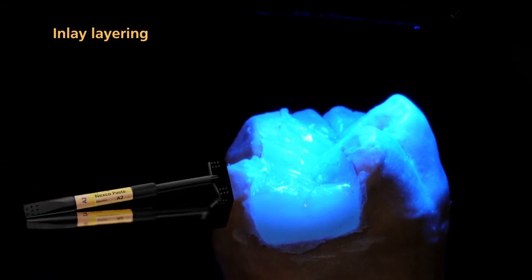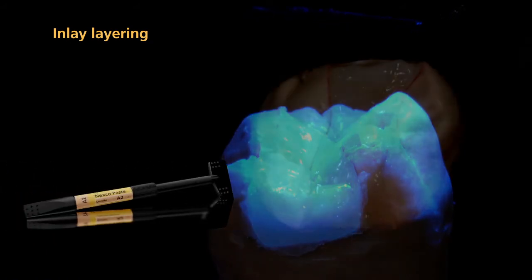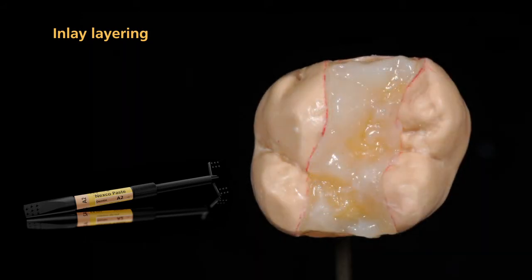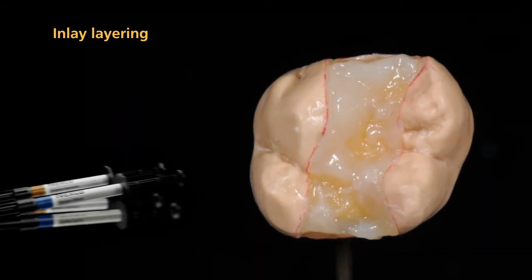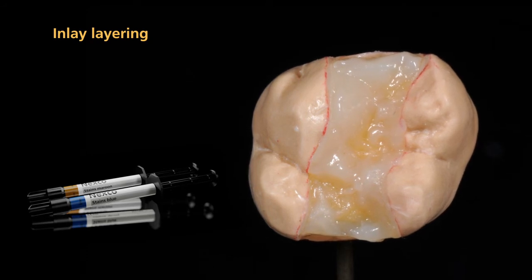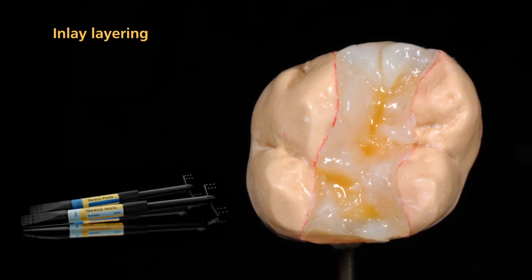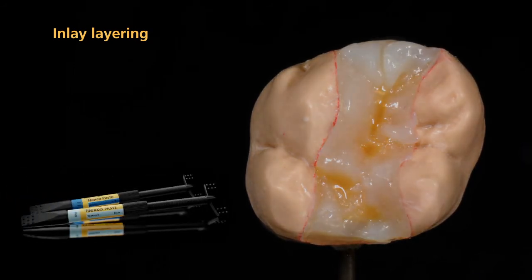Slightly emphasize the marginal ridges with dentin. Subsequently, build up the dentinal plateau with dentin materials. To intensify the shade effect, apply characterizations with SR Nexco stains and cover them with incisal and effect transpa layering materials.